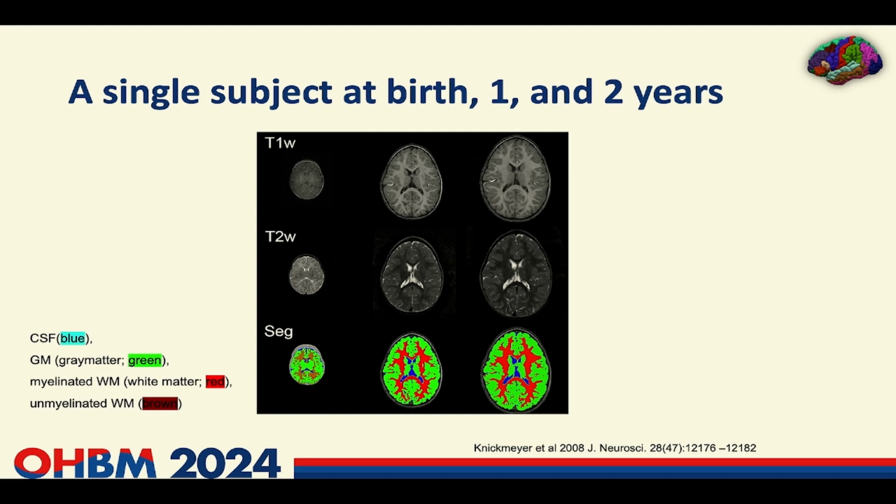So first I wanted to show you this picture. If you are not used to looking at infant brains that are developing, they represent a significant challenge when we are trying to write post-processing tools. And I think this figure illustrates some of the challenges quite well.